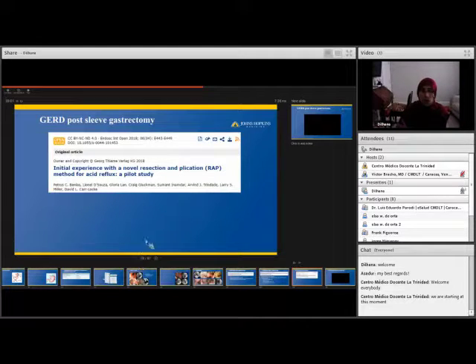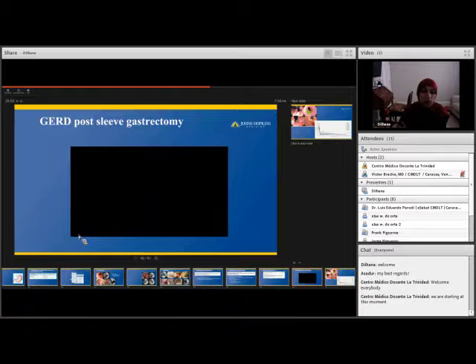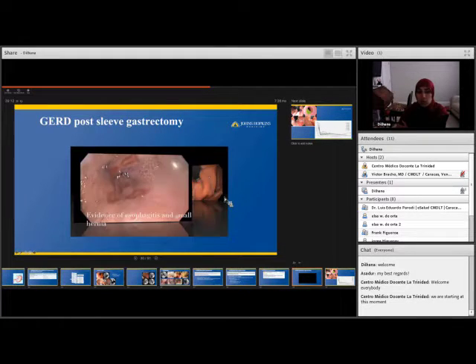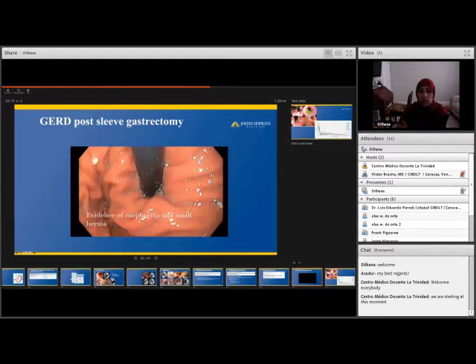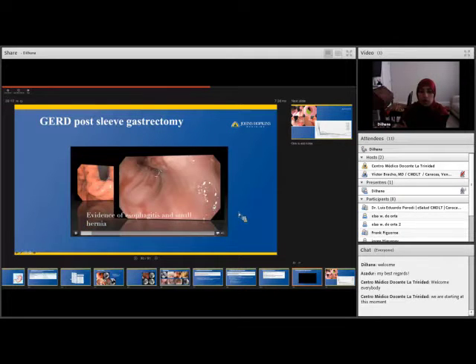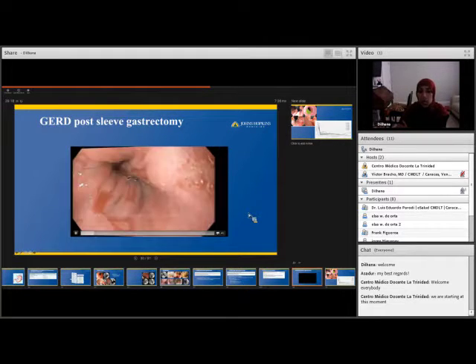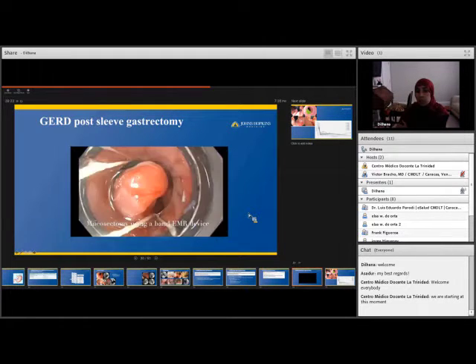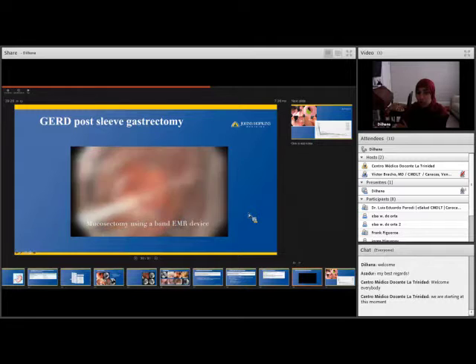So now I would like to talk to you about a very novel procedure. It's called a RAP. It's a resection and plication procedure. This is the pilot study done by Petros Benias. And I'm going to show you his video. This is not a Hopkins video. This is from Dr. Benias. And here he does what they call a resection and plication, which is really quite interesting.